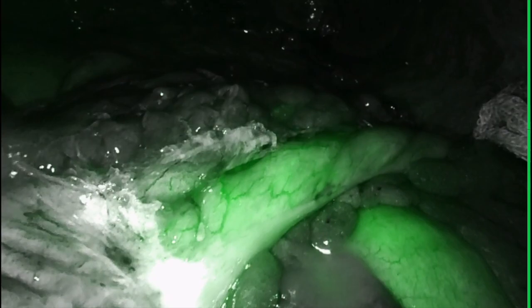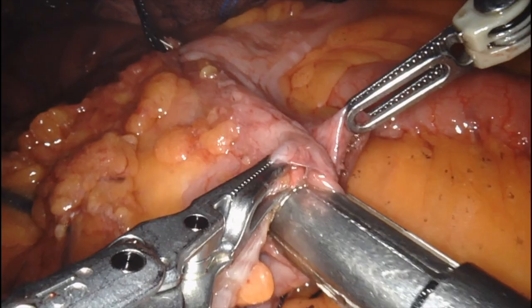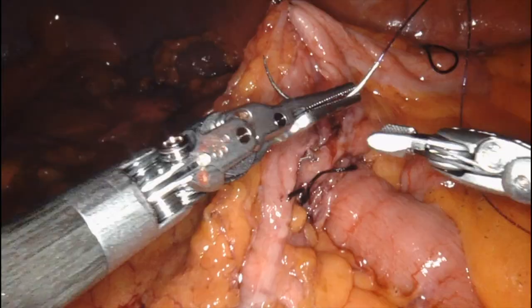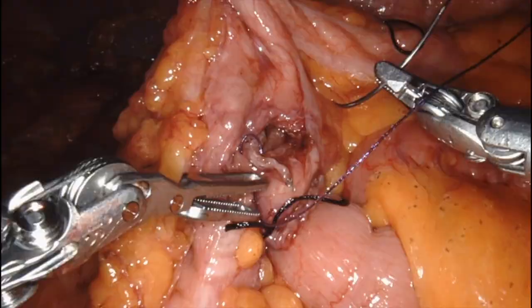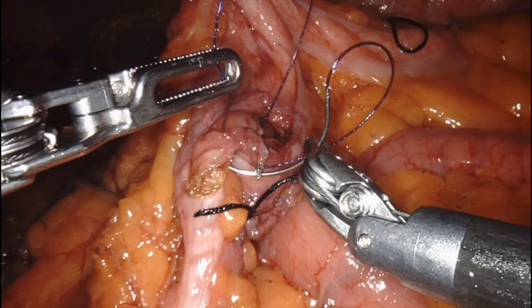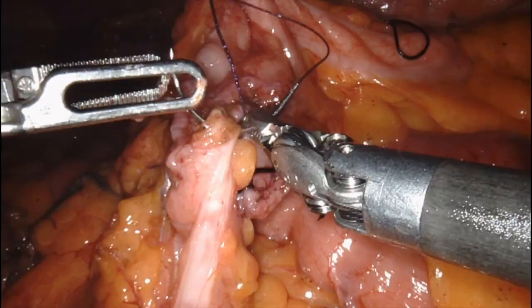Once I select my margins I go ahead and resect them. Unfortunately we do not have fancy robotic staplers here, so the stapling is done manually — I won't put you through watching a regular stapling on both edges of the resection. I decided to do a vascular load on my anastomosis from the transverse colon to the descending colon, and I closed the common channel with a 3-0 V-lock suture in a single layer, making sure I take several bites and that there is no exposed mucosa or gaps between my stitches.